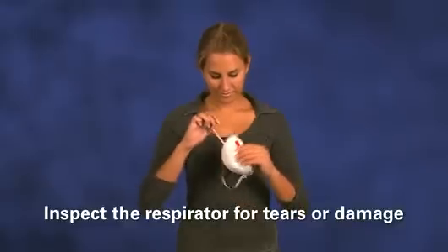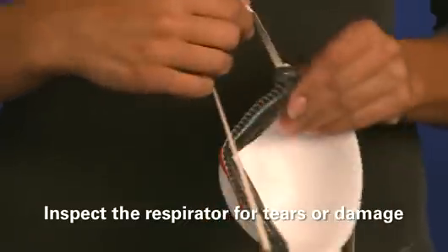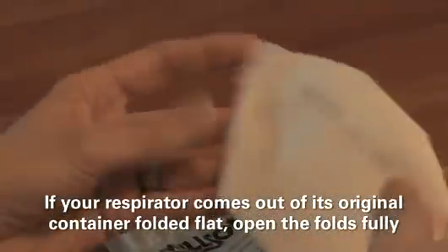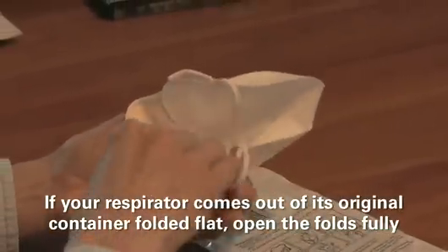Inspect the respirator, including the straps, for tears or damage. If you find any damage to the respirator, replace it. If your respirator comes out of its original container folded flat, open the folds fully, following the manufacturer's instructions.